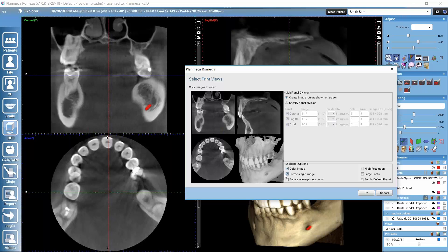We have a couple of further options. We could determine whether we want the image colored or not, and whether we want to create one single image containing all 4 views or have 4 separate images. Then we could generate images as shown on screen, change the resolution, or make the fonts larger. If we always prefer to use specific settings here, we can save them as default presets so they are always pre-selected. Let's now continue to Print Editor with these options.